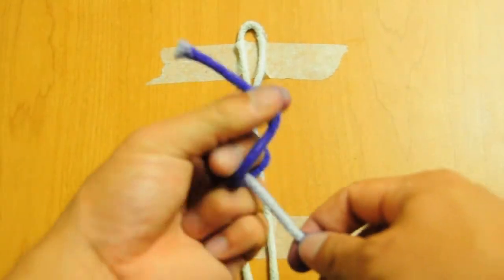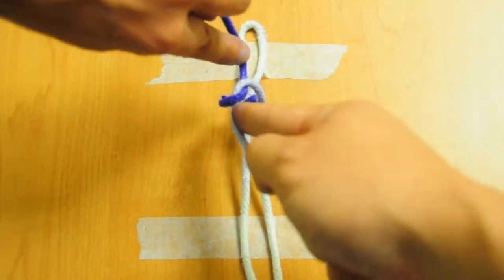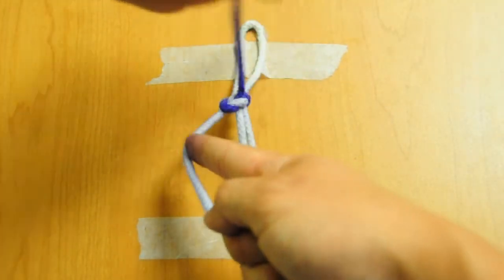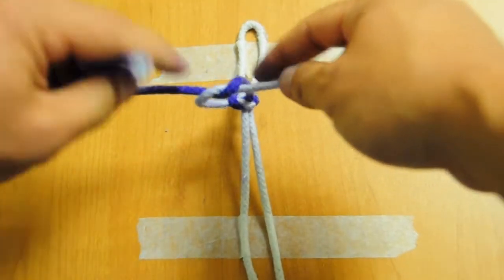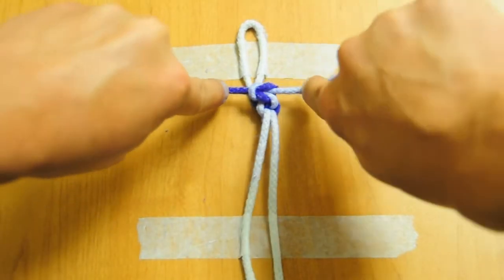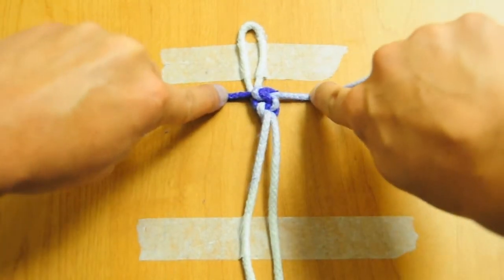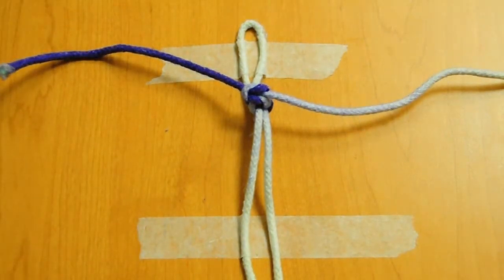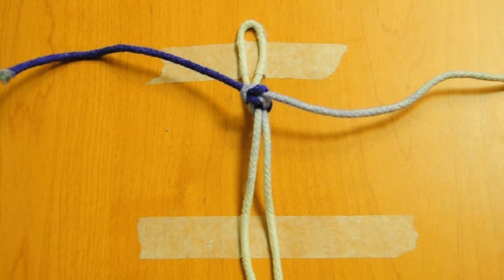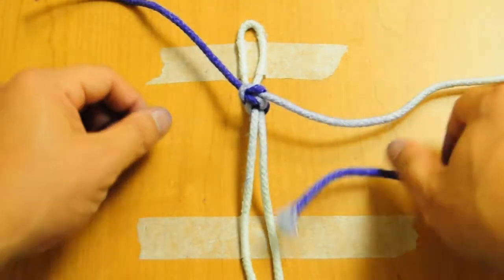Go back to the middle finger throw, cross, next finger, again. Nice, pretty square knot. This is what happens when you don't have equal tension on your sutures.